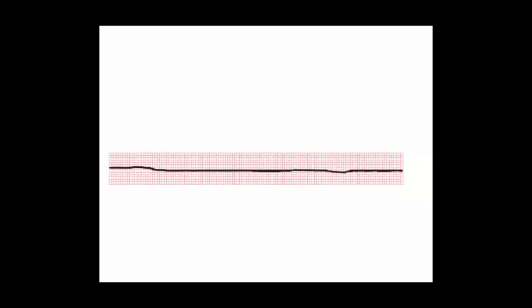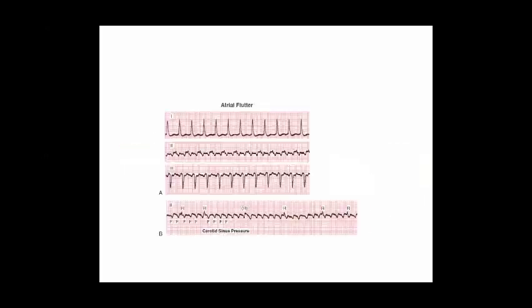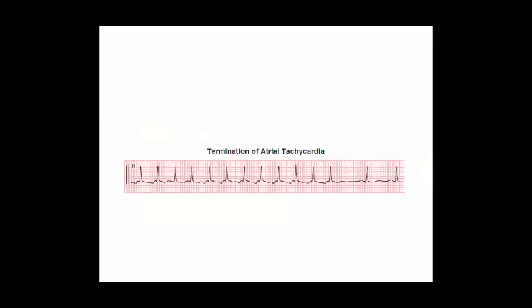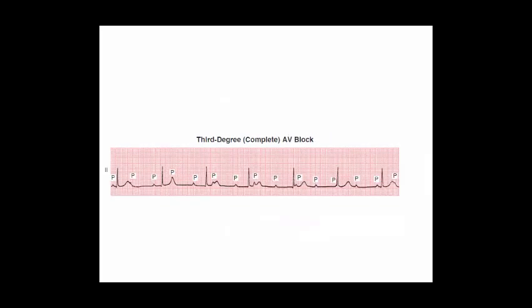Here, this is another form of arrest rhythm, the asystole. Asystole, and if you see this, you need to start cardiopulmonary resuscitation, CPR, but you should check connections, because if the connections are wrong, you will have this without the patient being arrested. So we just took a hint on supraventricular tachycardia, ventricular tachycardia, and ventricular fibrillation.